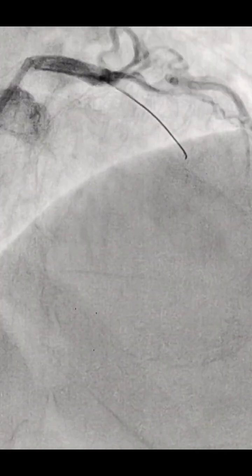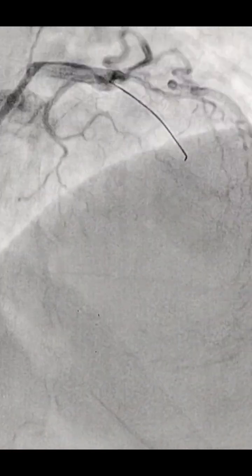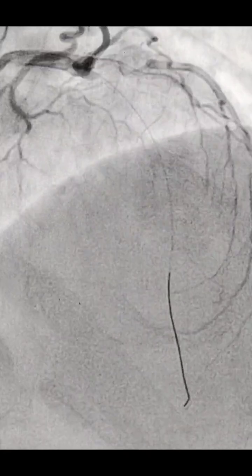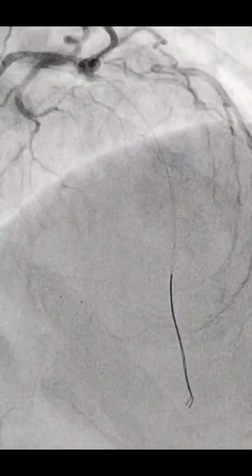So I took a workhorse wire which was run through, and easily I crossed the lesion, but as always the flow is not there. This is the cranial view, and you can see the wire. This wire seems to be in the LAD, but there is no flow, and I was sure that the wire is in the LAD because you can see the shape. This is the cranial view, and then again with gentle movement I progressed the wire, and this is the progression of the wire. Then we gave tirofiban, nicorandil, everything we have given, but the flow hasn't come.